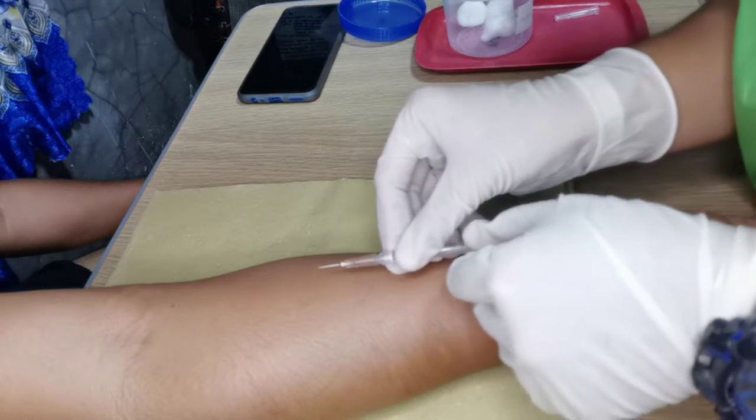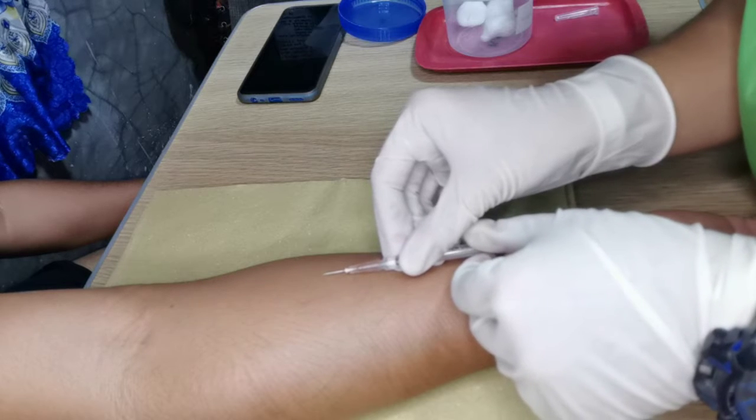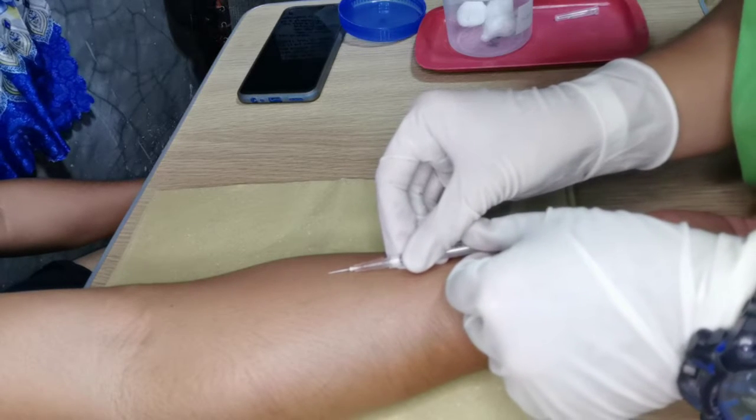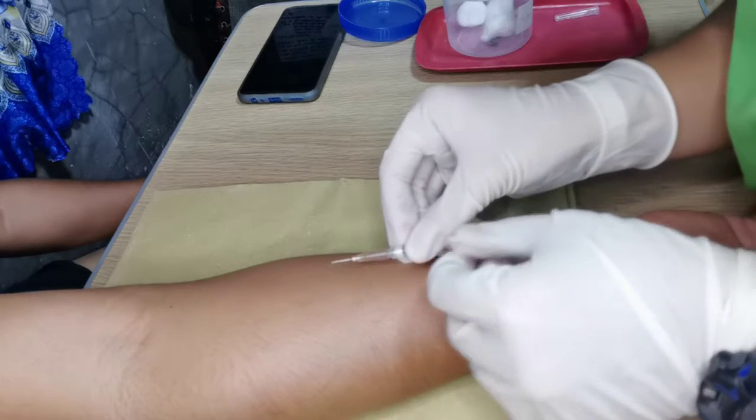Remove the needle cap with the non-dominant hand by pulling it straight off. Use the non-dominant hand to spread the skin taut over the injection site. Hold the syringe in the dominant hand between the thumb and forefinger with the bevel of the needle up.